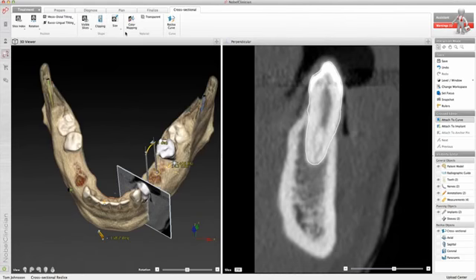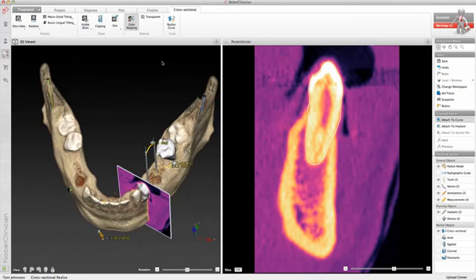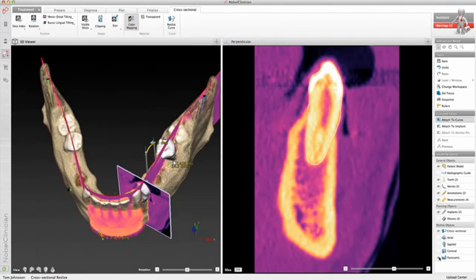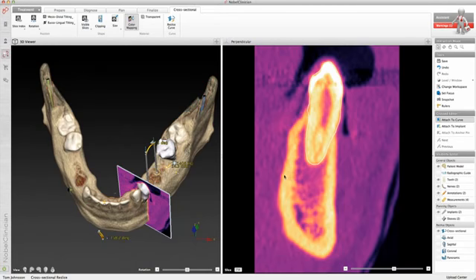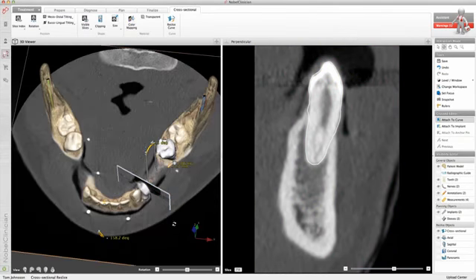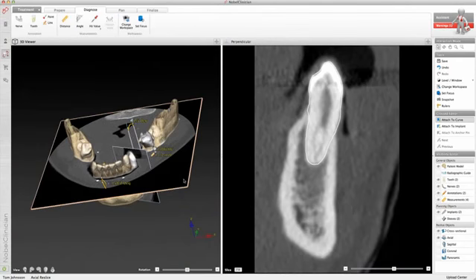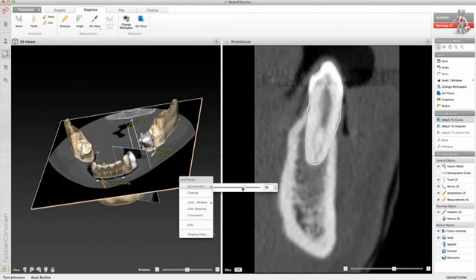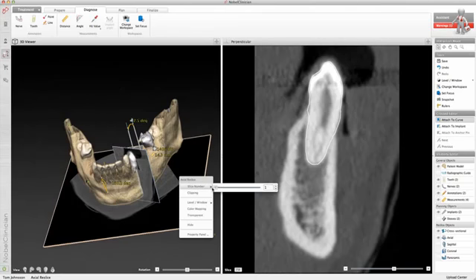In the Materials section, you can also activate Color Mapping. When activated, all reslices, including the OPG or Panorex, will display in colors instead of grayscale. Color Mapping can be useful to diagnose specific anatomical structures on the X-ray data. Several of these diagnostic functionalities are also available for the standard reslices and the panoramic reslice. To access these functionalities, right-click on the reslice in the 3D viewer and select the desired action from the contextual menu.